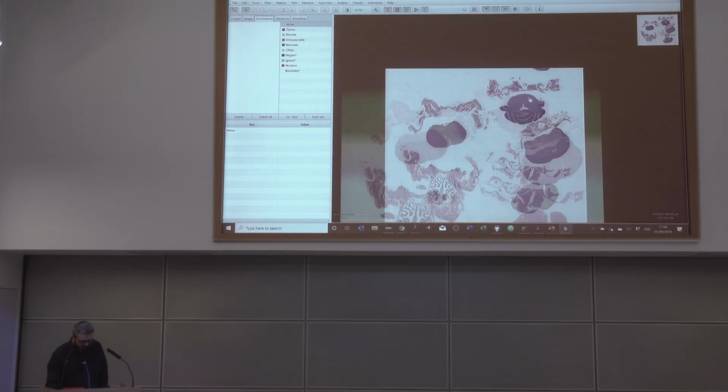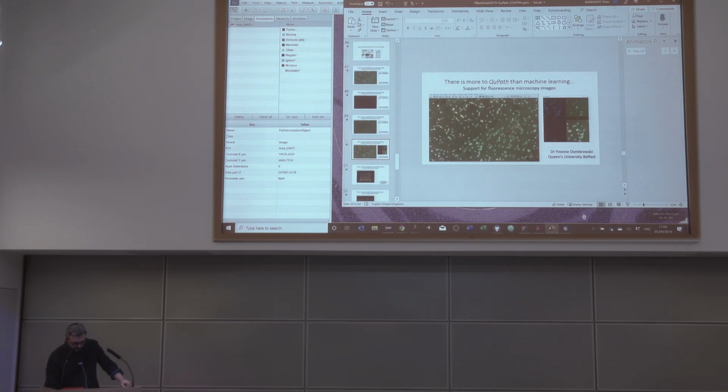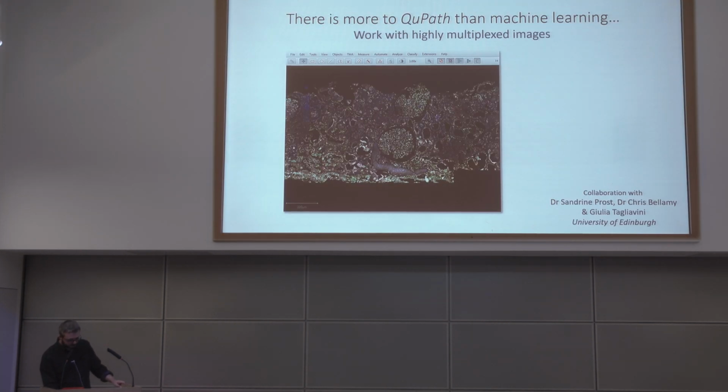And if all goes well, okay, so now we have it in here and we can begin to run QuPath's analysis tools or annotation tools if we want to. And so we have access to images, even if they're not there locally. We can get them from this open source OMERO image management system. And so that's going to help with running larger projects at scale.